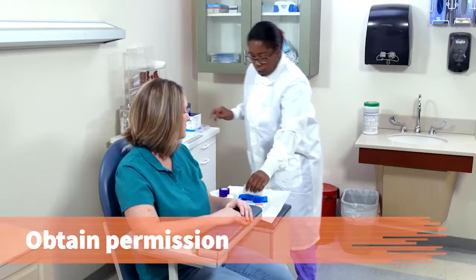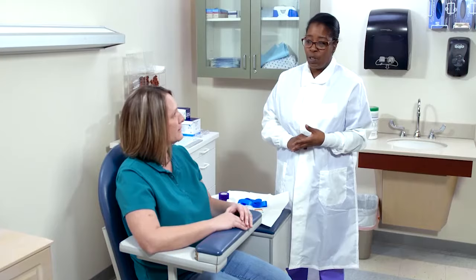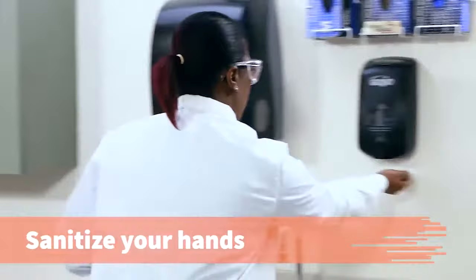Explain the procedure and obtain permission for the venipuncture. Tina, it looks like Dr. Anderson has ordered some blood work for you to have done today. Do you have a problem with getting your blood drawn or had any issues? No. Put on protective eyewear and sanitize your hands.